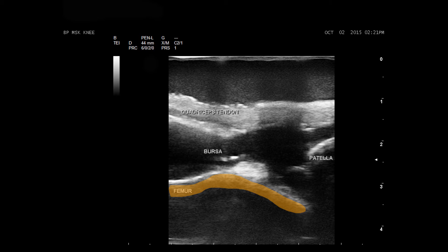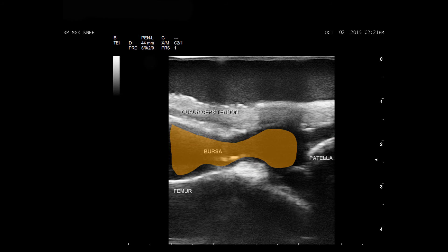The model contains the distal femur, proximal tibia and fibula, patella, quadriceps tendon, femoral fat pad, quadriceps fat pad, bursa, and the joint capsule.